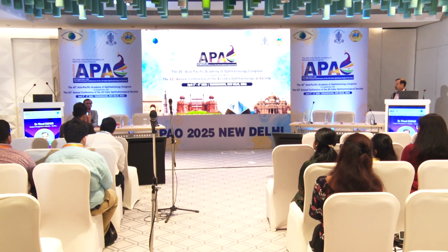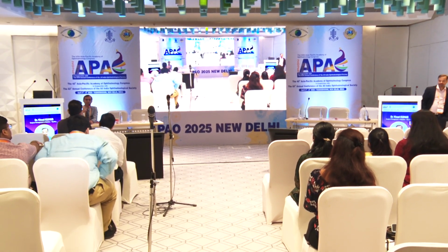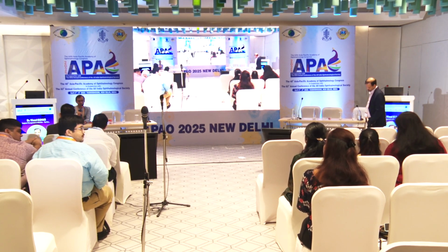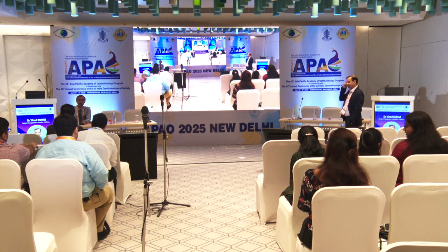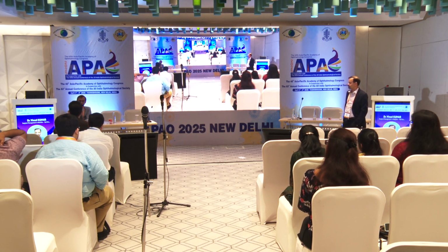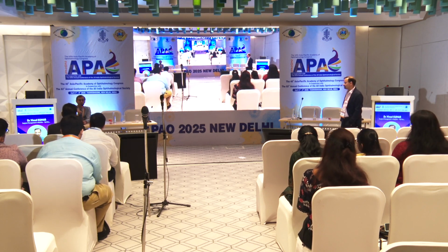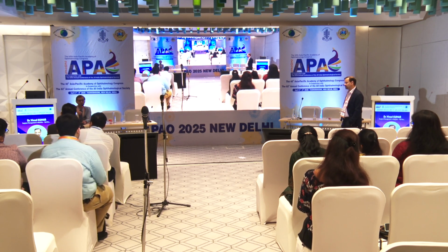Yeah, so encerclage probably again has become a surgeon's preference. So if you believe in encerclage, you will put an encerclage. If you don't believe in encerclage, you will avoid. So that depends. If it's a very localized RD, then you can go ahead with it. So you're talking about prophylactic buckle? That would be a broader indent, but would it actually help? I don't know, because again at the edge of the buckle you can get the break. So I don't. What would you say?